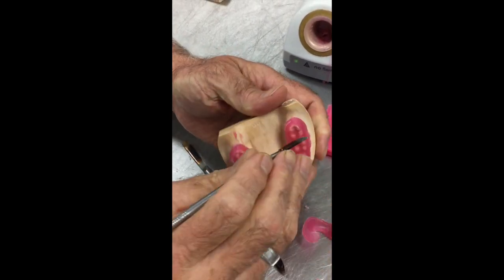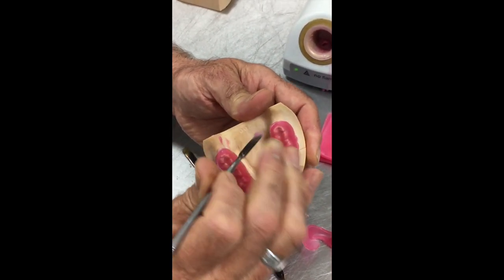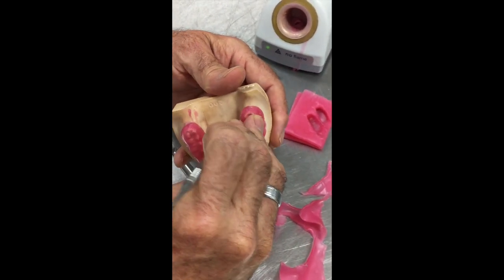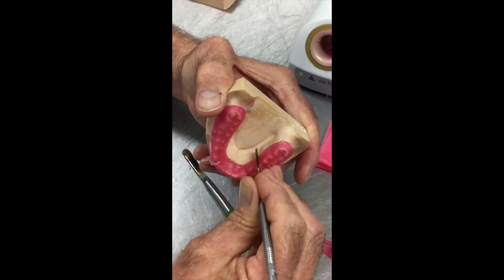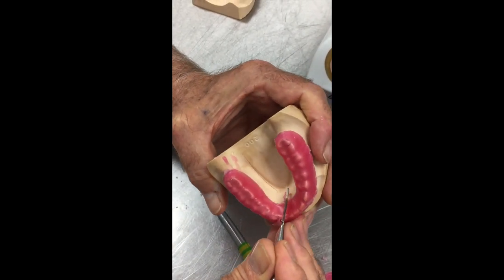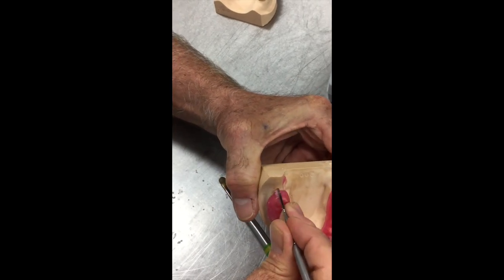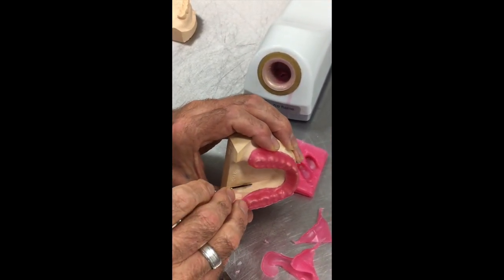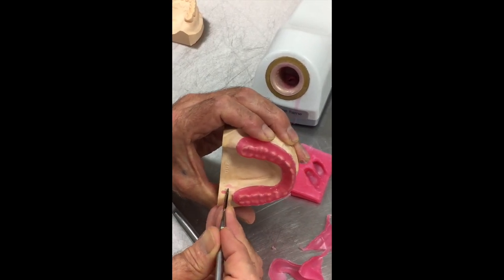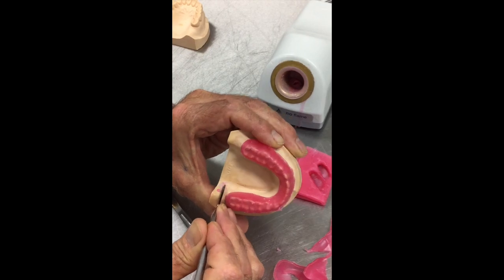Just going to make sure that this little fold here where it wrapped around that tooth is nice and even. You can see that little edge that's been curled up by the wax. I'm just taking that off at 90 degrees to the cut that I've made. So do take note of the fact that the cut was made perpendicular to the surface all the way around. I didn't cut it on an angle down like that. We don't want the tray to taper in.